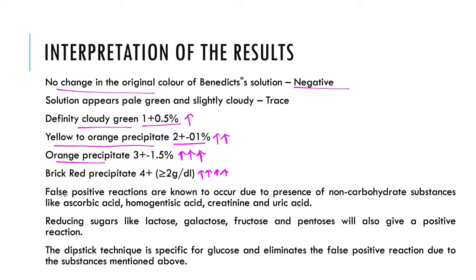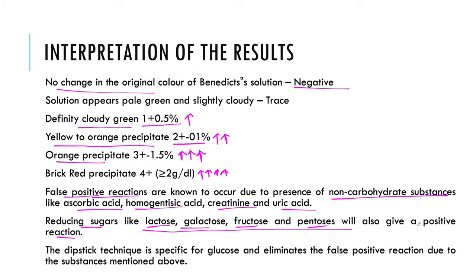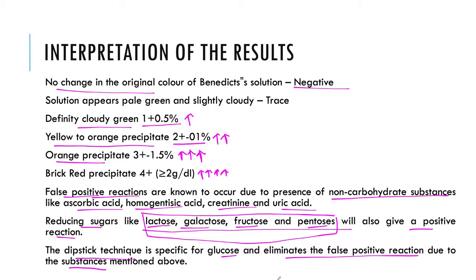False positive reactions can also occur due to the presence of non-carbohydrate substances such as ascorbic acid, homogentisic acid — which is an acid produced due to a metabolic disorder — and creatinine and uric acid. Reducing sugars like lactose, galactose, fructose, and pentose will also give a positive reaction, so if these are present instead of glucose, it can give a false positive result. The dipstick technique is specific for glucose and eliminates false positive reactions due to substances like lactose, galactose, fructose, and pentose.